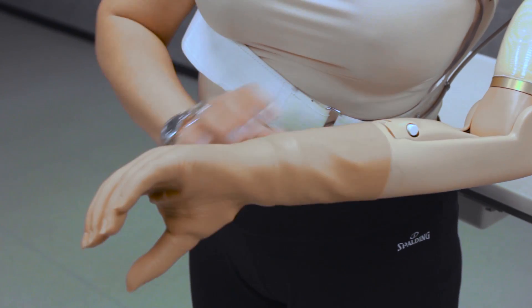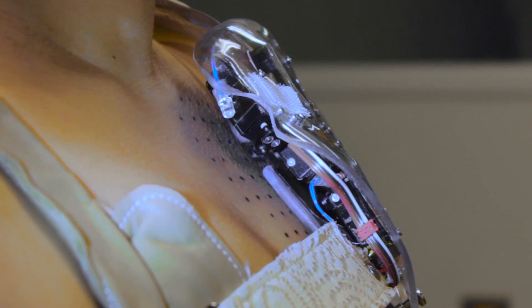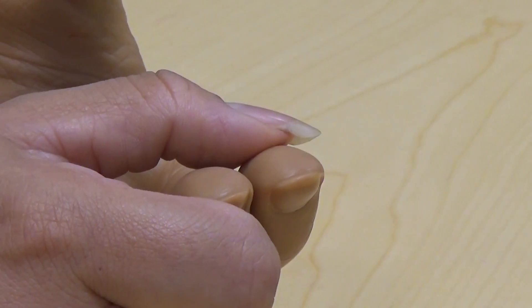With each touch, sensors embedded within the robotic hand activate touch robots that interface with the study participant's re-innervated skin.